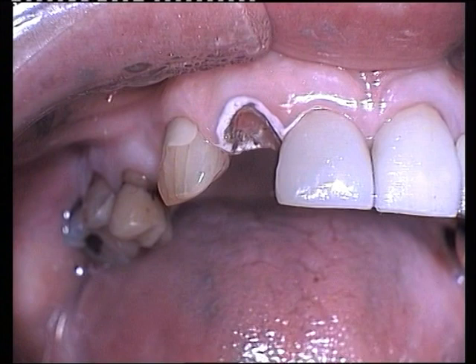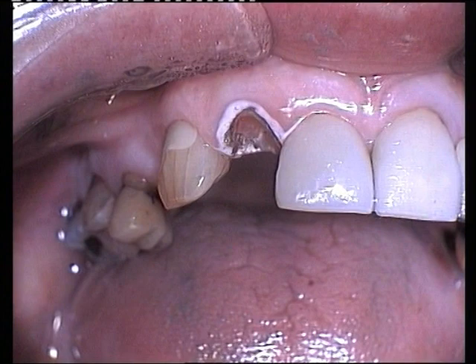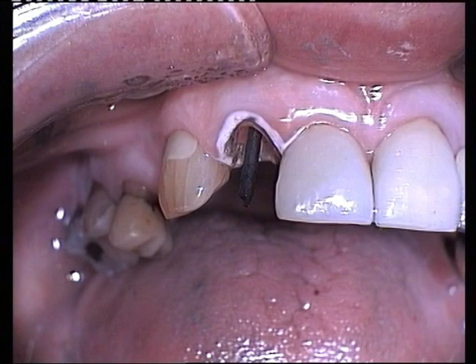The post is placed into the cavity and measured for length. After the post has been trimmed to size, it is placed again near the canal and checked that it is clear of the occlusion in centric, protrusive and lateral movements.